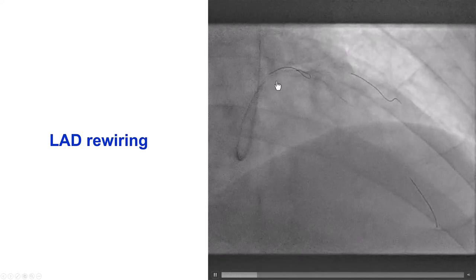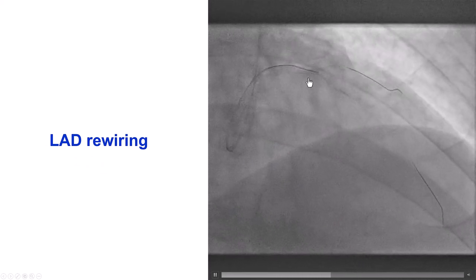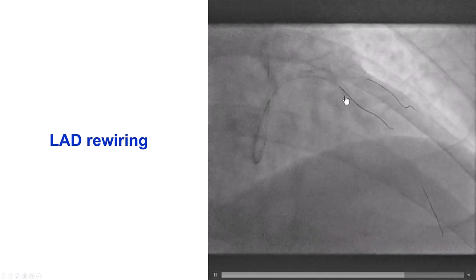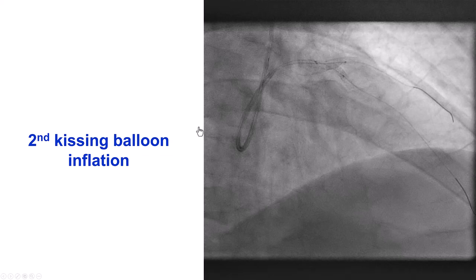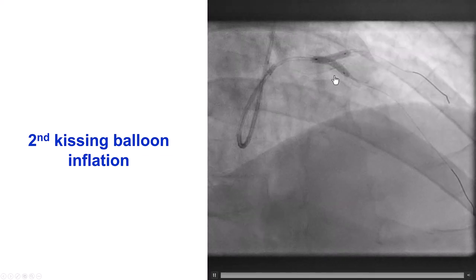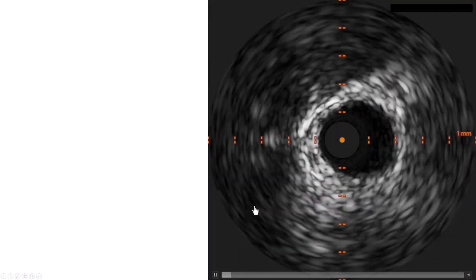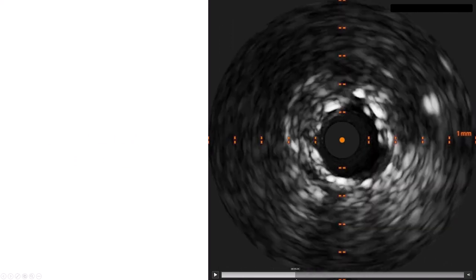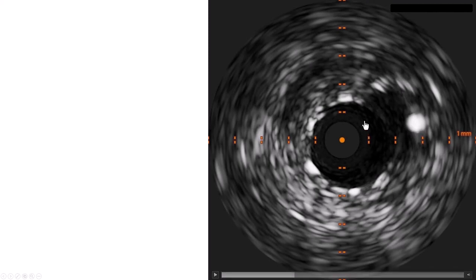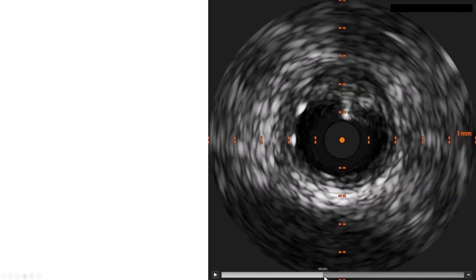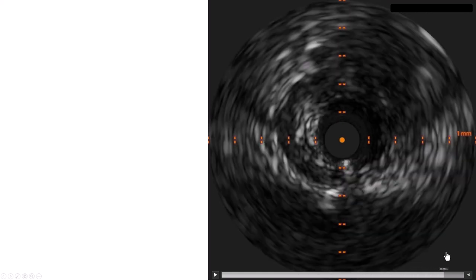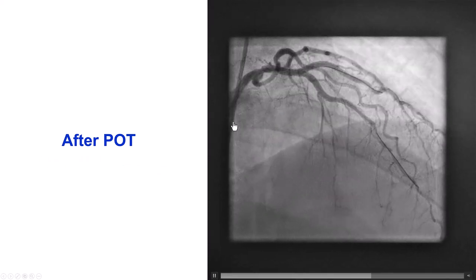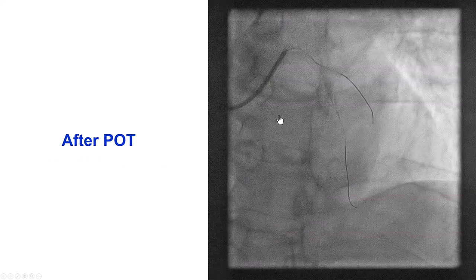The second stent was deployed. After doing that, we rewired. There was not much discrepancy in size, so we did not do proximal optimization, but this was a workhorse wire that easily advanced through the diagonal stent struts. We then delivered 3.0 mm balloons again and performed the second kissing balloon inflation, with good expansion as expected based on the IVUS findings. Intravascular ultrasound showed good stent expansion. The origin of the side branch looked pretty good without much jailing from the stents, and more proximally the vessel looks good. We did proximal optimization with a 3.5 mm balloon and things look good.